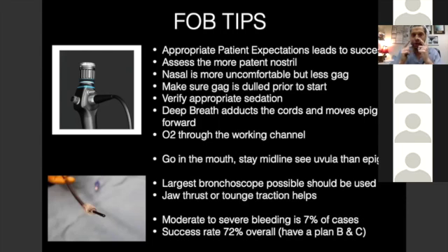Assess the more patent nostril in the holding area. Breathe through each nostril, see which side's more open, and then go after that nostril. Nasal is more uncomfortable, but there's less gag. So if you don't feel topicalization is great, nasal is important. Now, there's other times when nasal is good, like the surgeries in the mouth or something like that. But I typically go through the mouth because they're usually for abscesses and tracheal tumors and things like that.